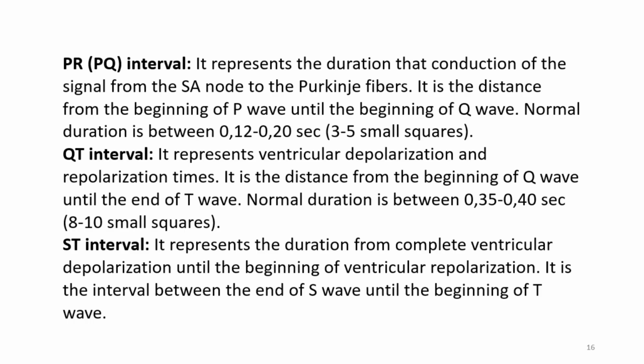QT interval represents ventricular depolarization and repolarization times. It is the distance from the beginning of Q wave until the end of the T wave. Normal duration is between 0.35 to 0.40 seconds.